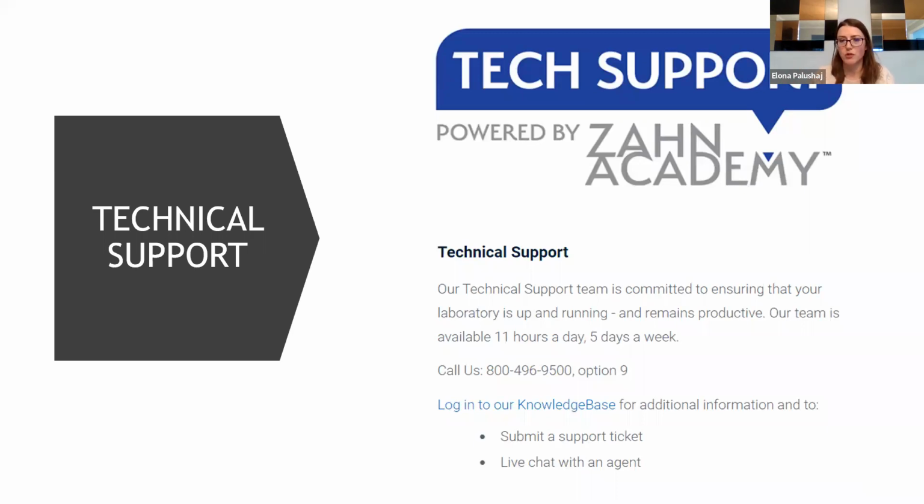That way, you know for sure that you are supported. You know for sure that your software is tested with the latest version of your CAD software, and it's tested with the latest version of Windows. Windows 11 is coming out soon, so that's something to consider. And there are all sorts of things that will affect the performance of the software that will require the update. So it's best not to wait until it's necessary.